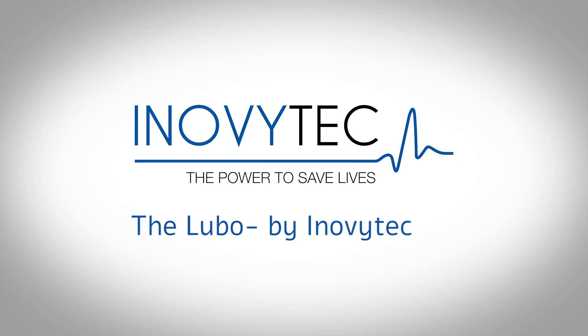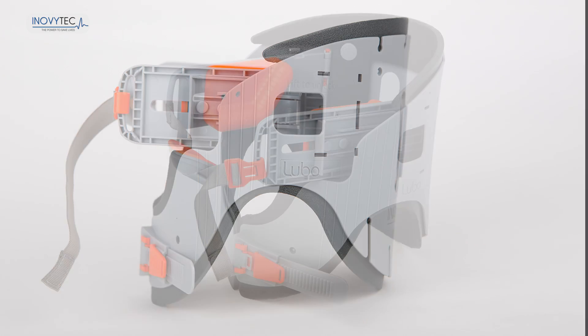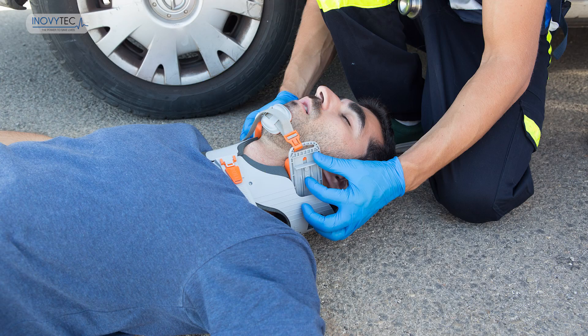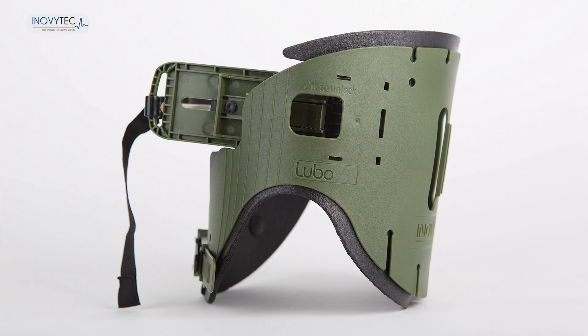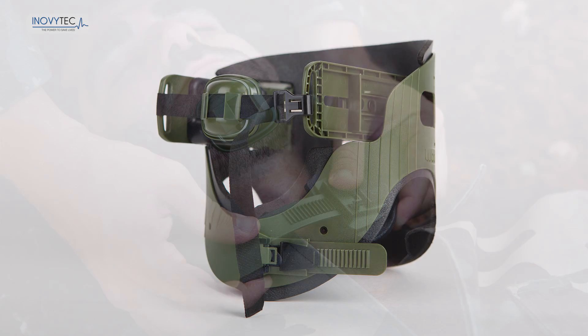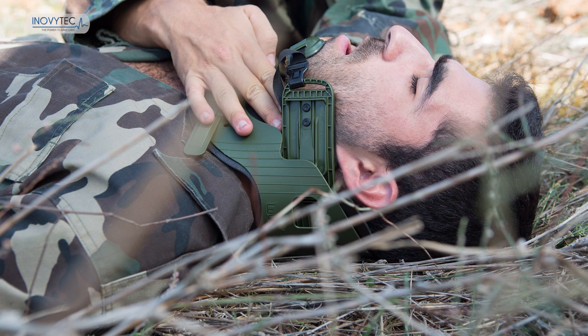The Lubo by Inovatec offers a unique solution enabling both airway and immobilization management in medical emergencies. It is the only non-invasive upper airway opening device which can open and secure the airway by imitating the jaw thrust maneuver while performing neck-free immobilization. The Lubo can be used by EMS professionals as well as any basic life support trainee.